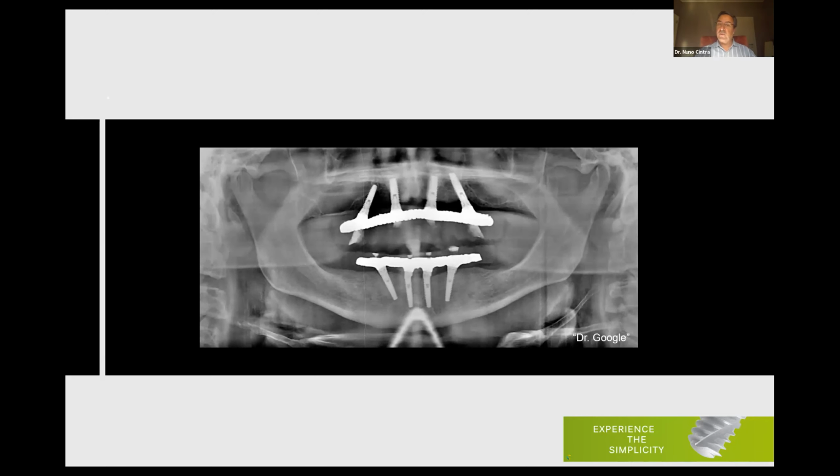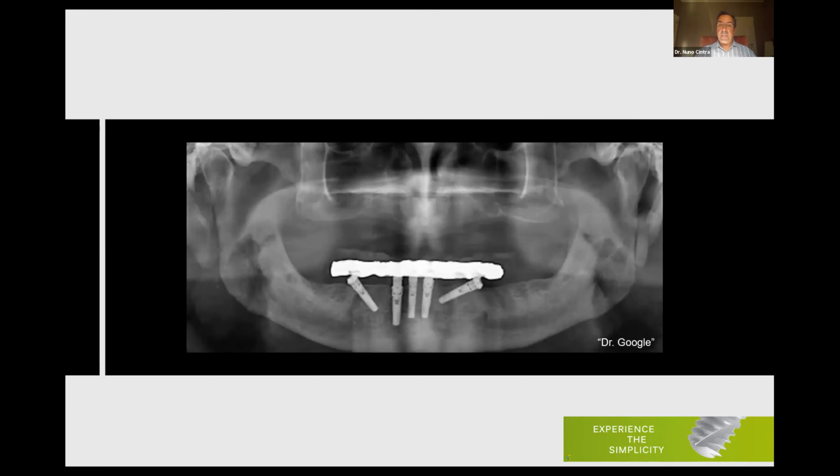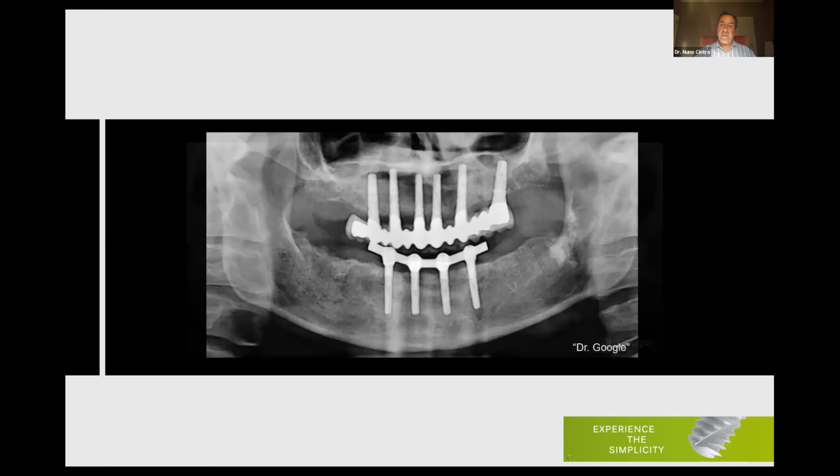This is also not what we're talking about. These implants were not correct. The angulation of the implants were not corrected with the angulated abutment. And this is definitely not what you're talking about. And look, all on 6, but the final one coming out on the 5. That's not what we are talking about.